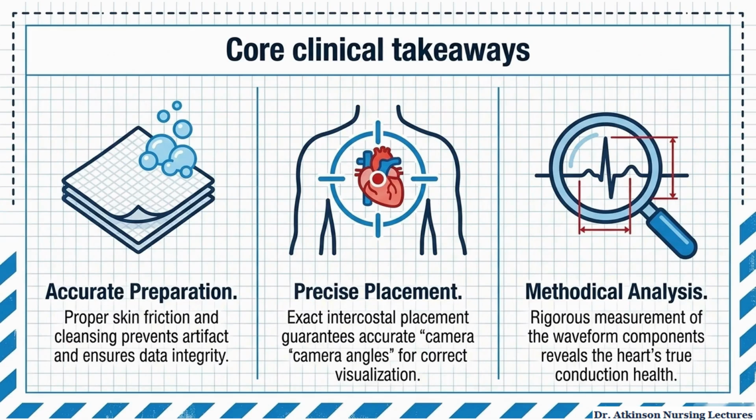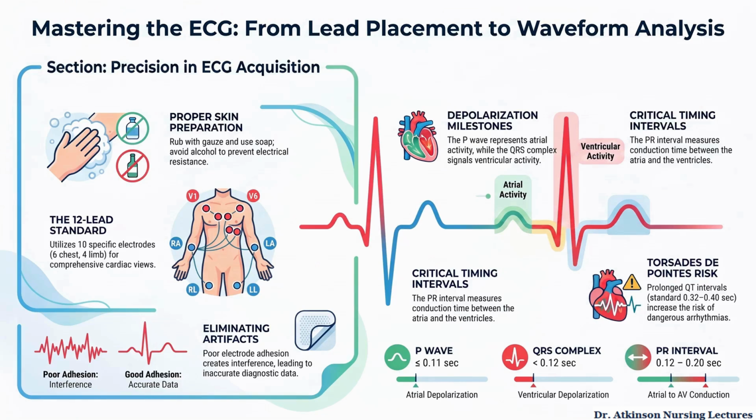In summary, accurate preparation prevents artifact, precise placement guarantees correct viewing angles, and methodical waveform analysis reveals your patient's true conduction health. This final overview ties every piece together: proper prep, correct lead placement, and the timing milestones of each waveform, all pointing you toward an accurate diagnosis.